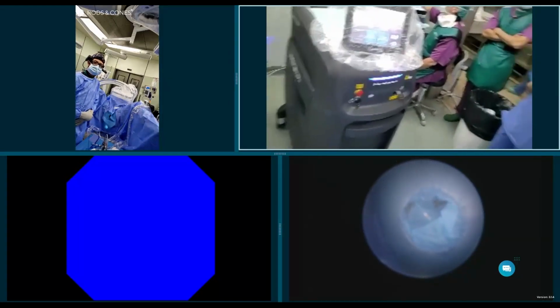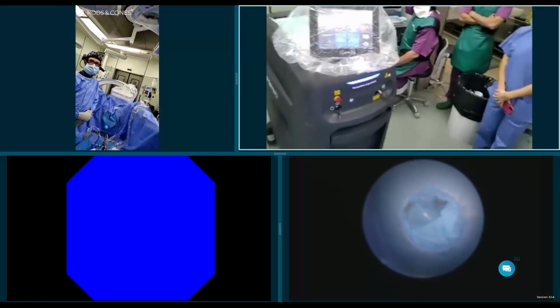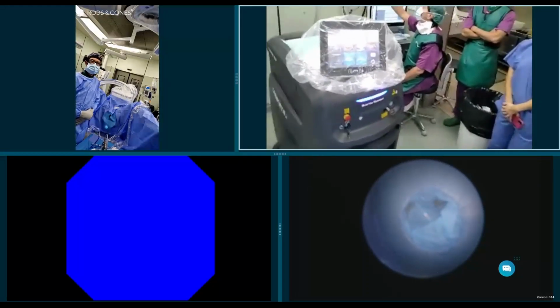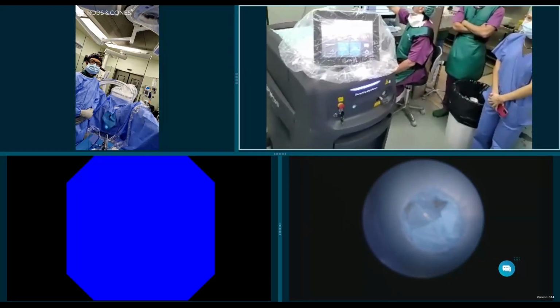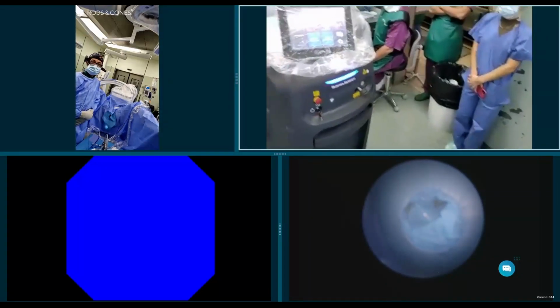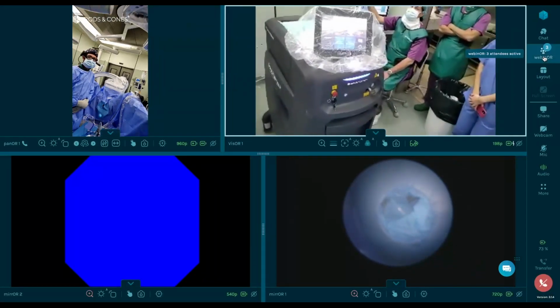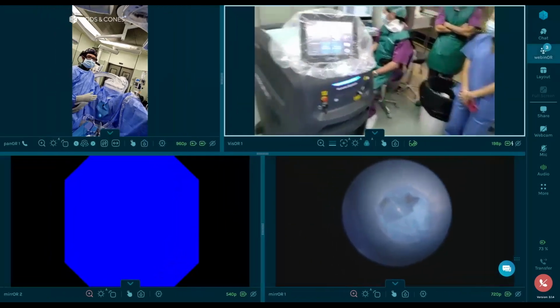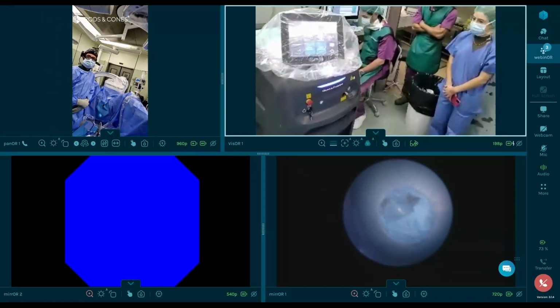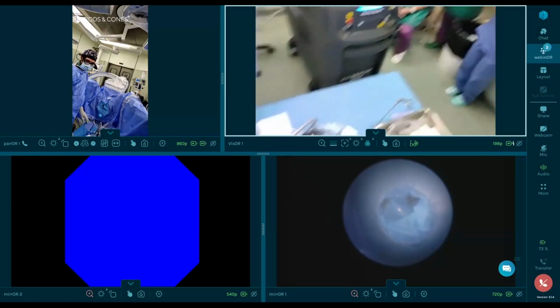So this is a case of a 39-year-old female patient with no relevant past medical history. This patient has a 14 millimeter stone in the mid anterior calyx that we'll see how we're going to manage. And she had a renal colic because of a 1 centimeter stone in the left ureter that needed a double J to be placed. So we're going to start now.